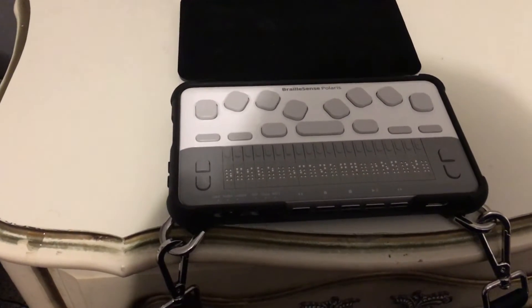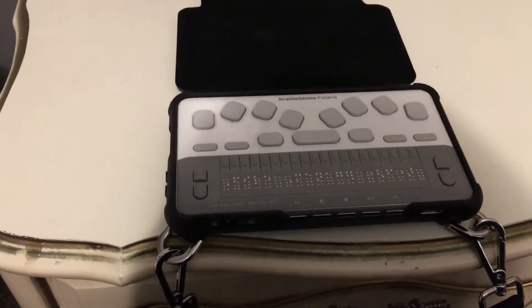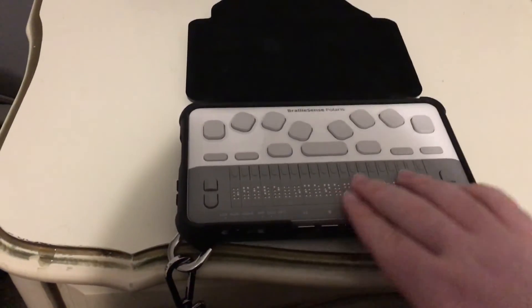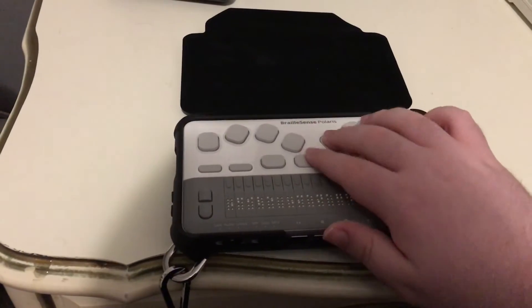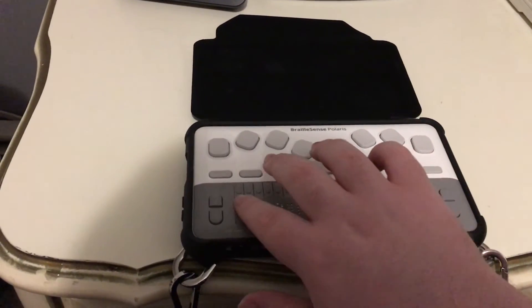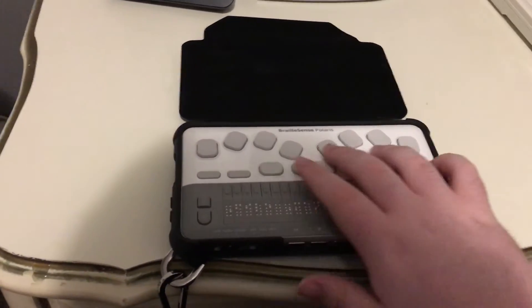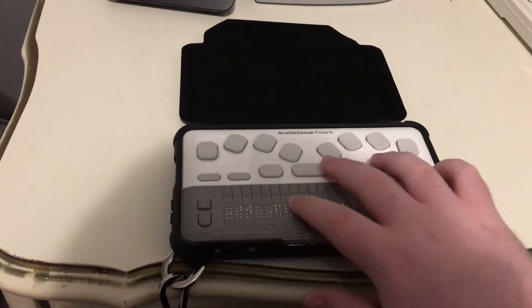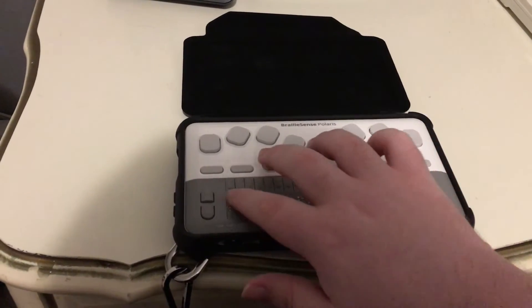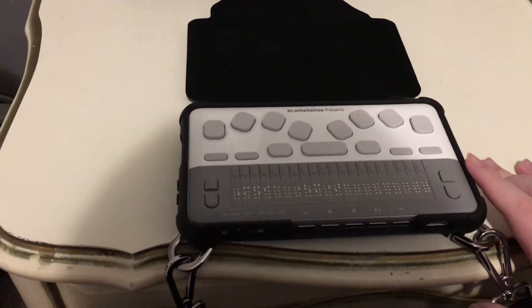That little chime you heard meant that the wireless has connected, so we're online. Now let's explore the menu. To do this, I'm going to use Space with Dot 4. I did Space with Dot 1 to go back to the top. With default speech settings, you can hear what it sounds like. There's File Manager. In this menu you have a Media Player, Daisy Player, and an FM Radio.